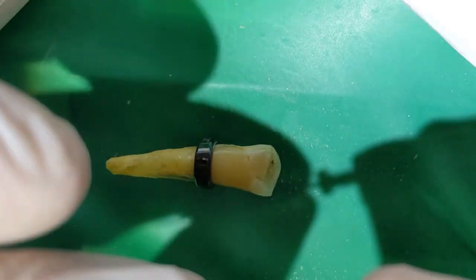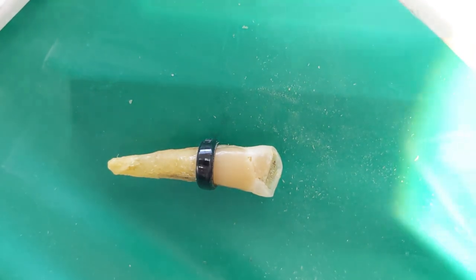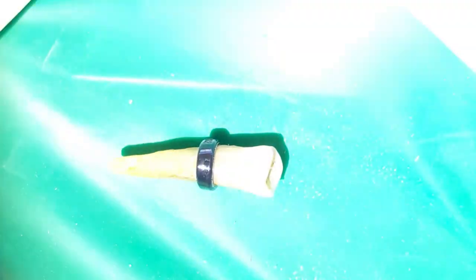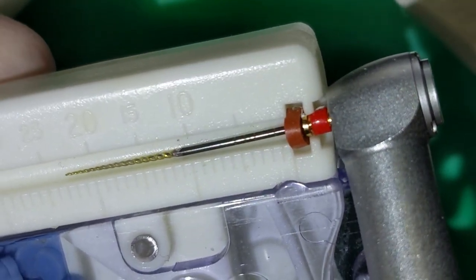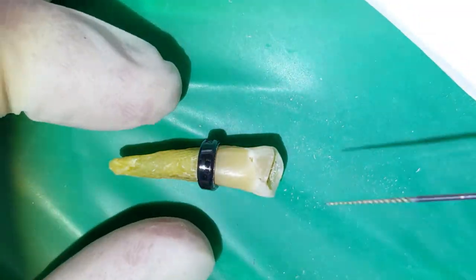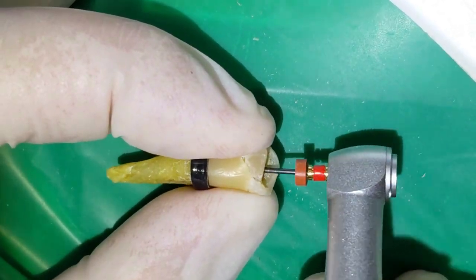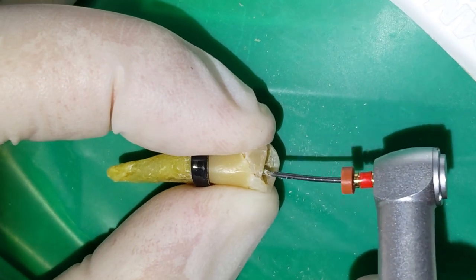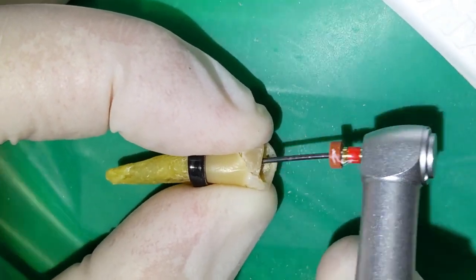Sometimes what I'll do too, if this file's a little tight getting in there, I'll use the next file up in size. That'll help me. So the next file up is a 24 millimeters again. And I'll just use this a little bit to make a little bit more room, and then I'll go back down a size to use the next file.